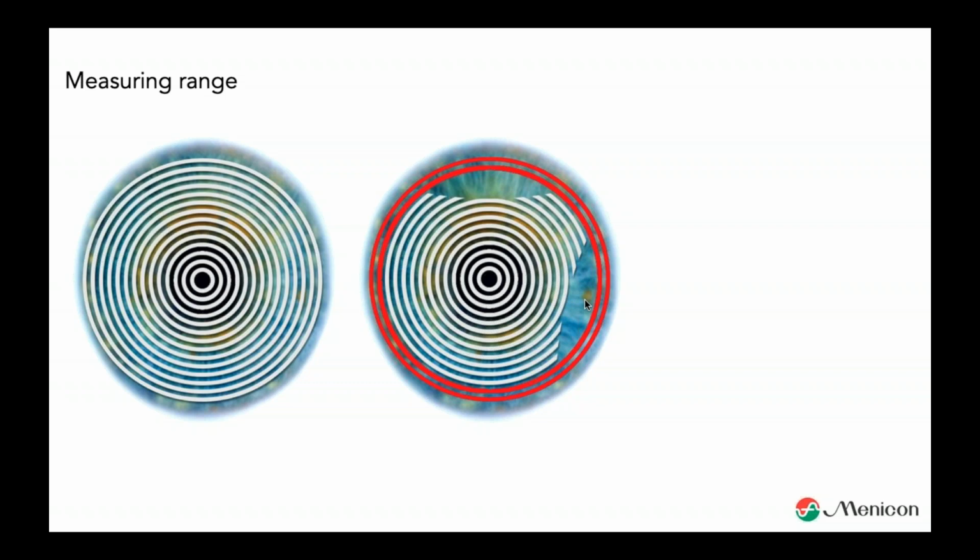The more you extrapolate, the more you assume something, and the more you assume, the more chance for mistakes. So if you have such a topographer, no problem, it will measure perfectly, but make sure you try to measure as large as possible. I have a quick tip later on in this lecture on how to solve that.